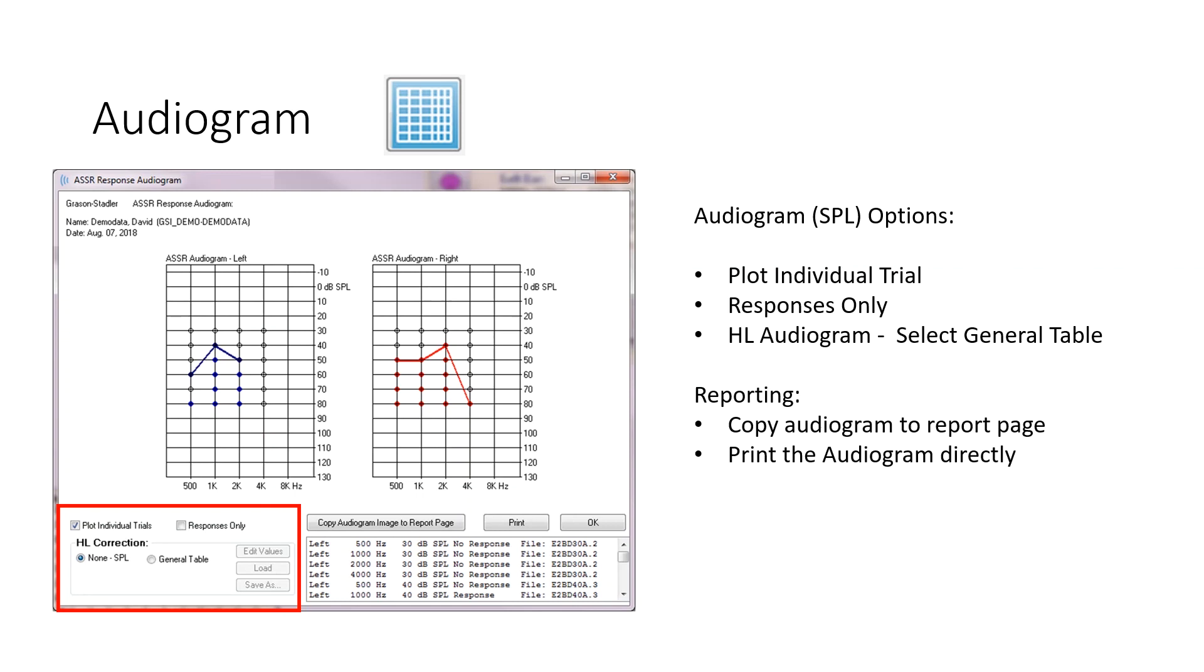For reporting, you can copy the audiogram to the page, so it's just going to take that audiogram and stick it on the collection page that you're on. Or for reporting purposes, you could be on any of the pages 1 through 9 that are available. Or you can print the audiogram directly.